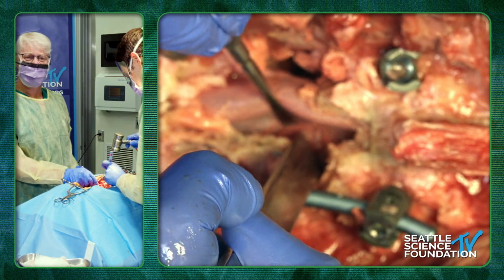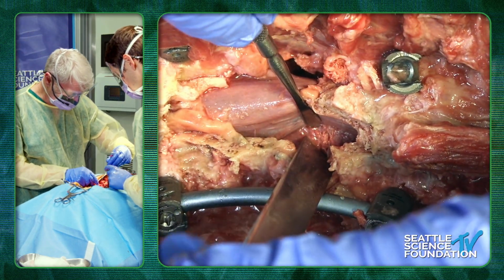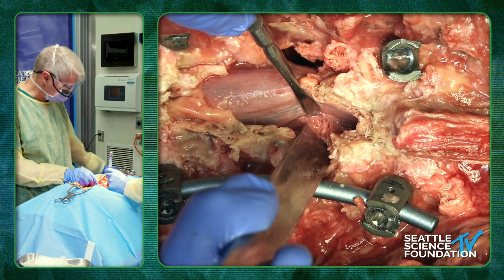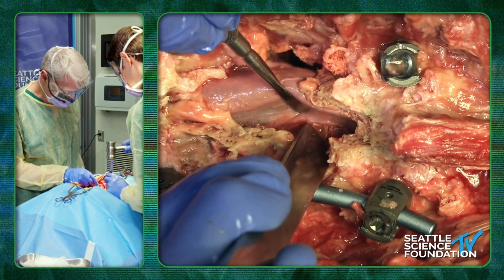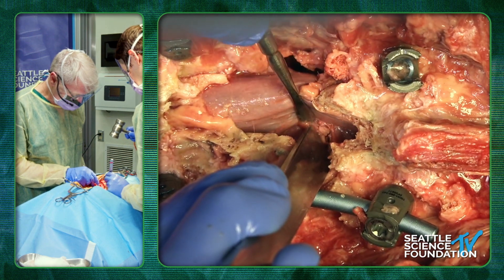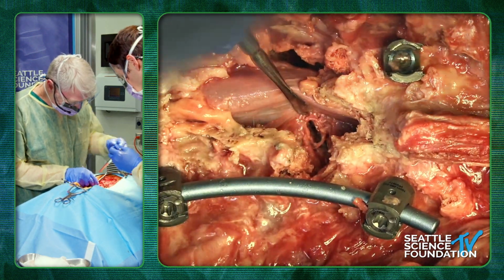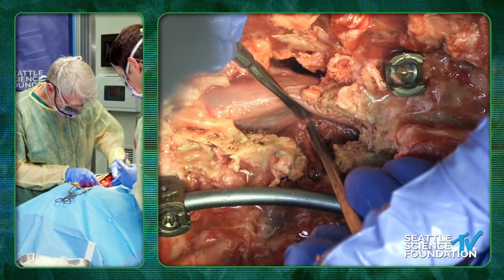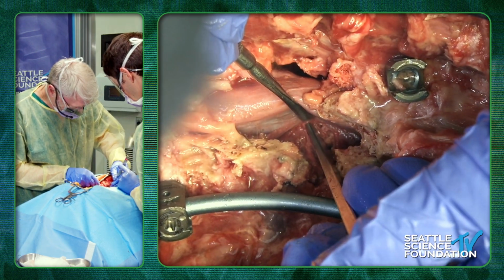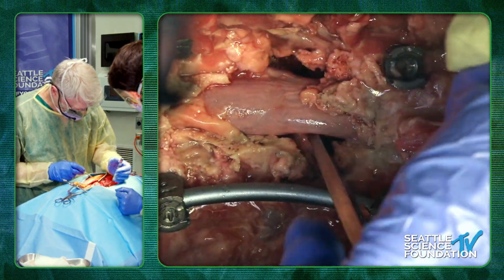And everybody can see. I want you to just hold it for an angle just so people see the angle. So you're above the pedicle. He's aiming to meet my triangle. Visual's great. Okay, see if you can get a little bit more. Okay, good. And take it out.